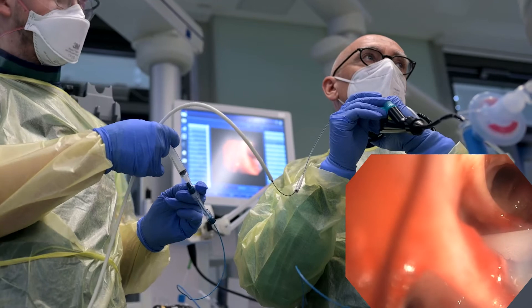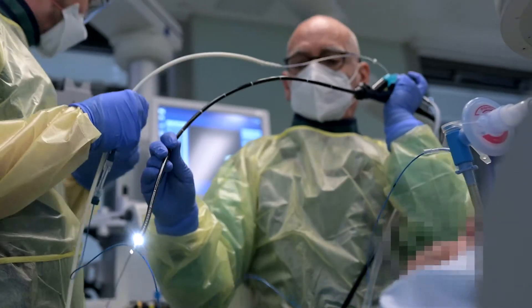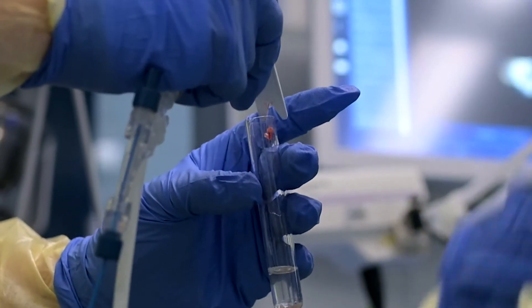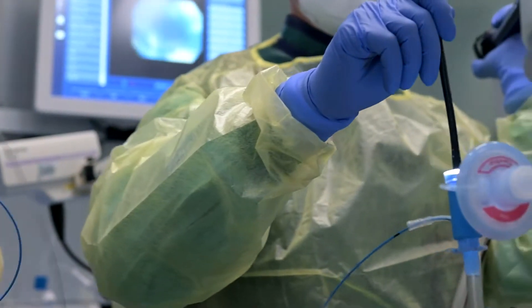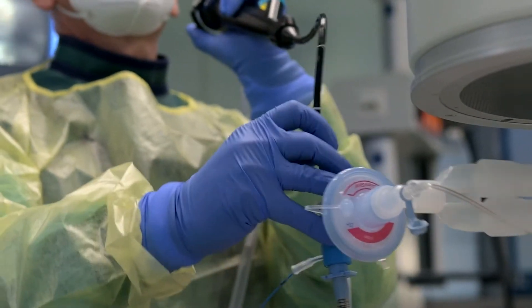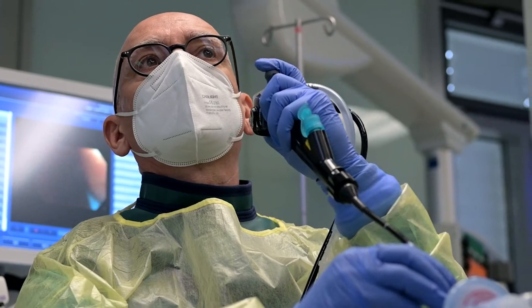The sample is harvested with a rapid movement of the bronchoscope, which is then fluently pulled out of the airway. Once the assistant can be sure that the tip of the cryoprobe along with the sample has passed the tip of the endobronchial blocker, he inflates the balloon with the predefined volume of air or fluid. The bronchoscopist keeps activating the freezing until the sample has left the ET tube. Earlier interruption of the freezing could lead to premature thawing induced by the patient's body temperature, and thus risk of losing the sample in the airway.